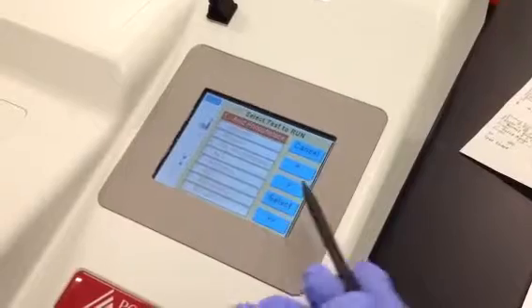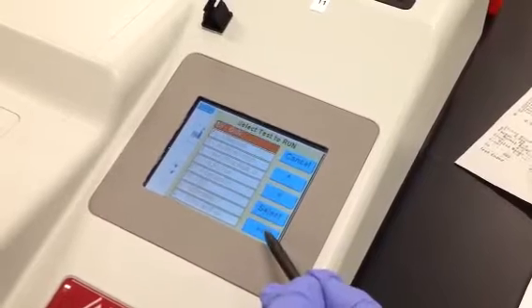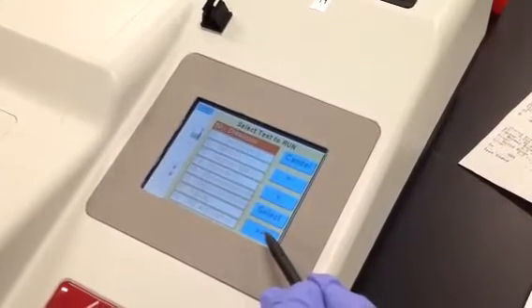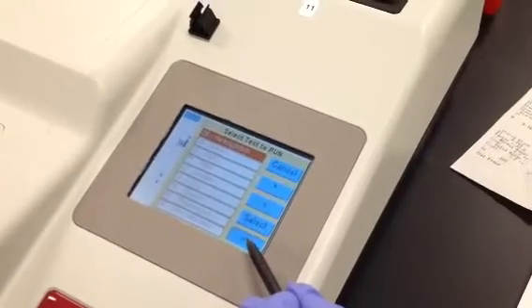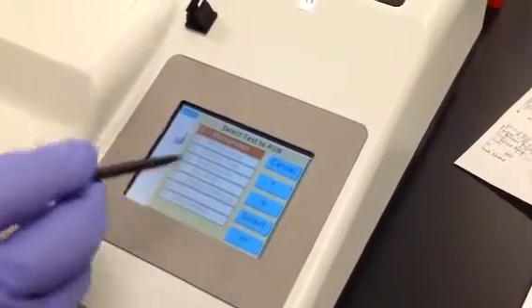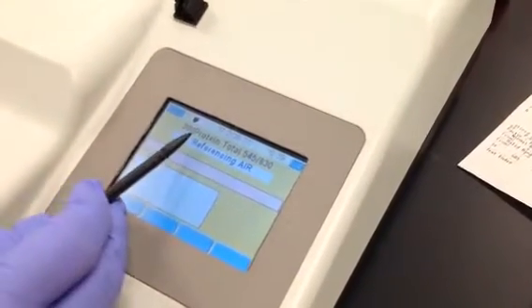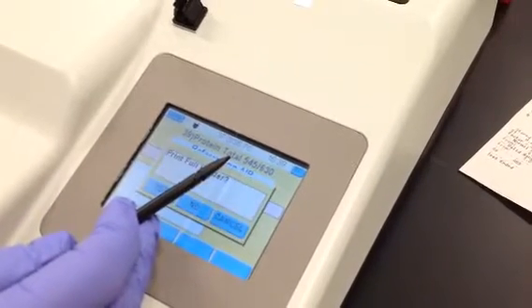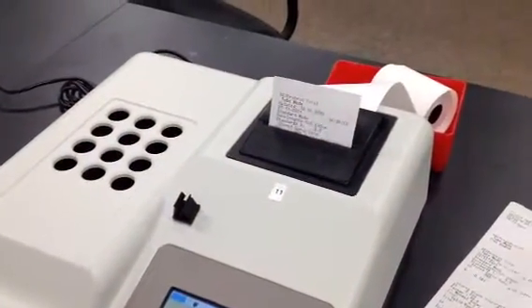And they're alphabetical. Single carets for line movement, double caret for pages. This is a protein/total, so it's under P's. So just page until you find it and choose the test you want. It's telling me that I have a protein, okay? Print full header, yes. That gives you some information that you need.